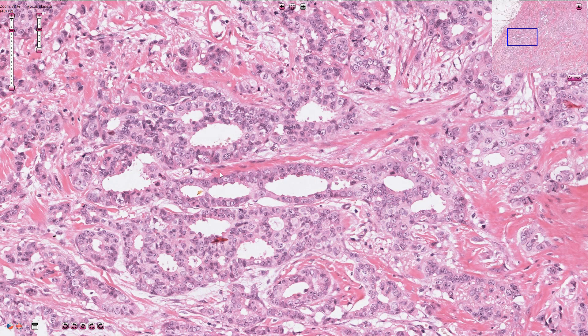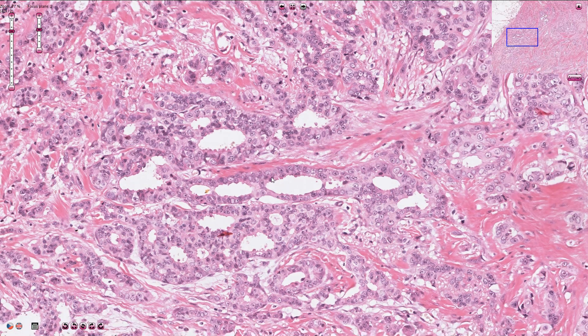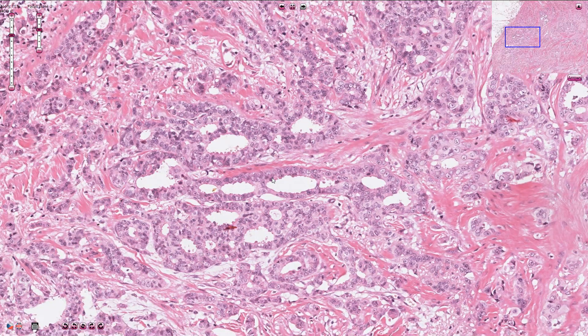We always need to grade this tumor based on the histomorphological features, and we use the architecture. Well-differentiated tumors have more tubular component and less solid component. We need to count mitotic figures, and the appearance of the nuclei is also quite important. We commonly use the Nottingham grading system.